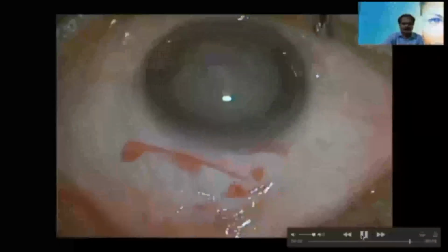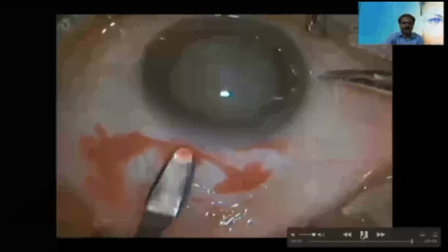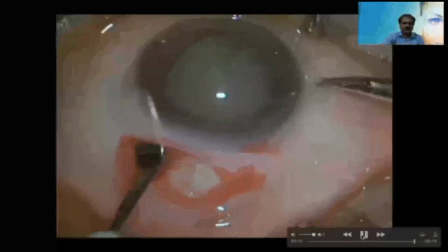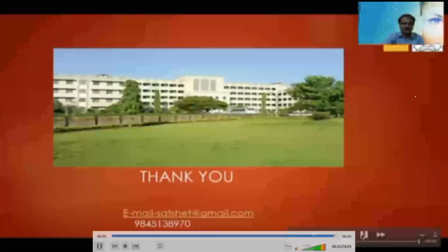And now coming to the tunnel flap here, where the surgeon is more comfortable doing the tunnel in a uniform plane, but once it comes to the lateral end, the tunnel is cut through.